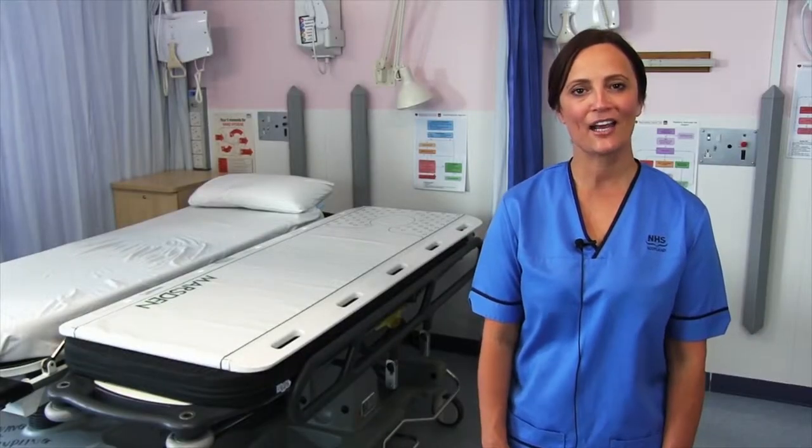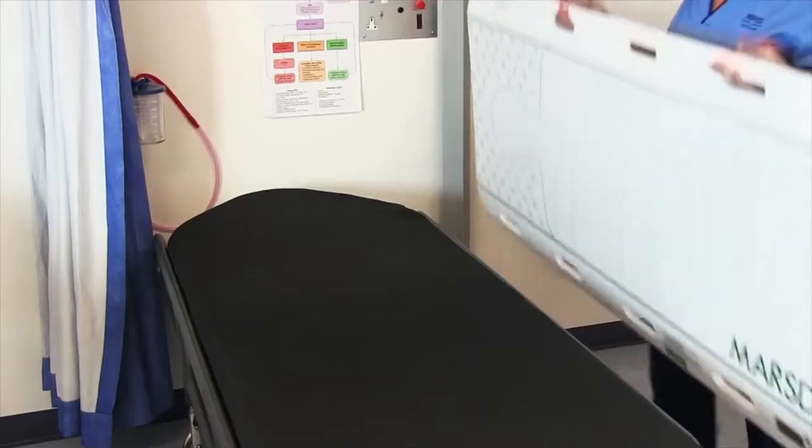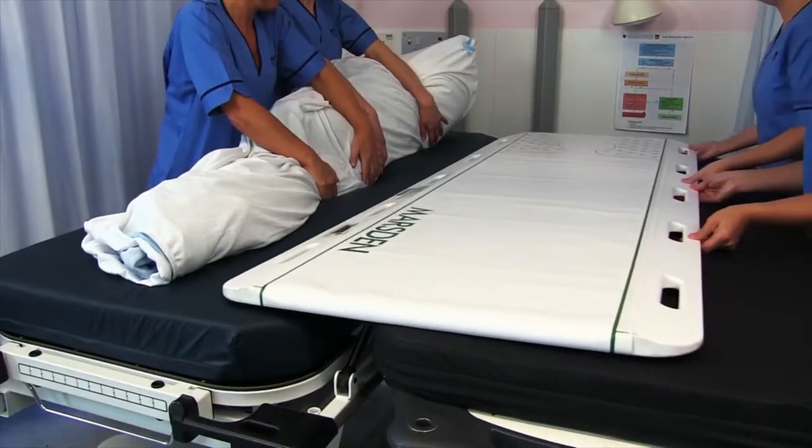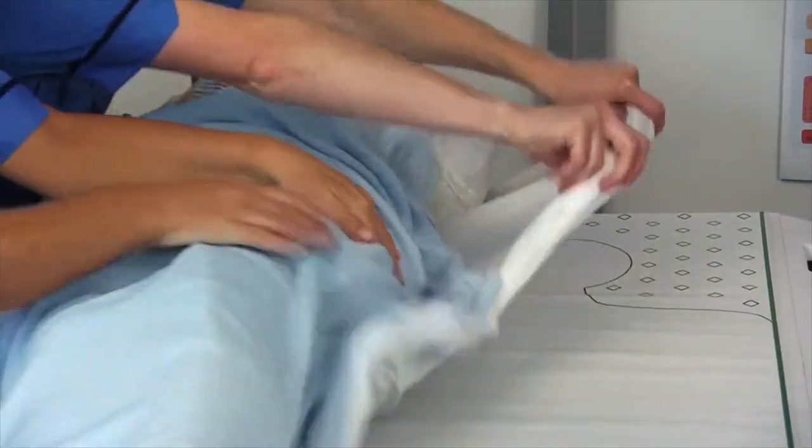Hi, I'm Gillian Taylor, inventor of the patient transfer scale. In this video, I'm going to demonstrate how to use the patient transfer scale to get an accurate weight for an immobile patient.